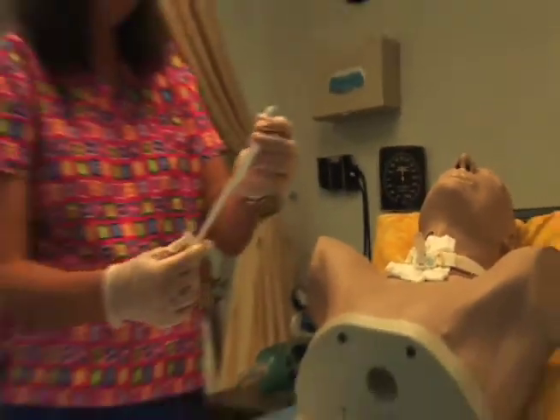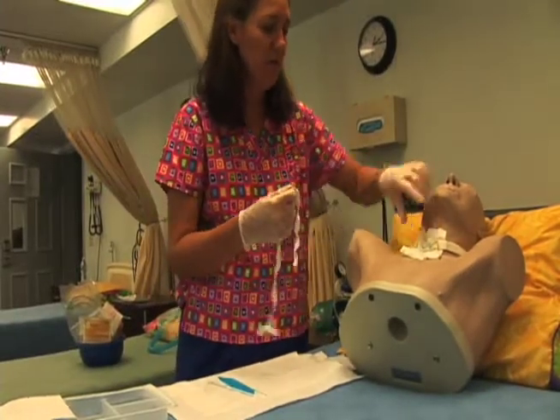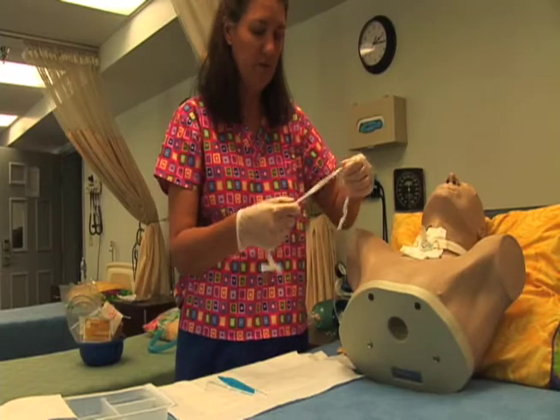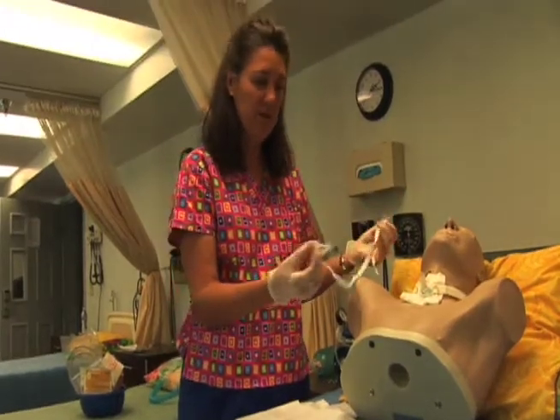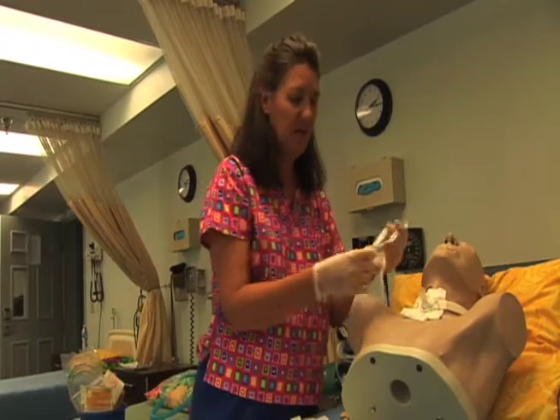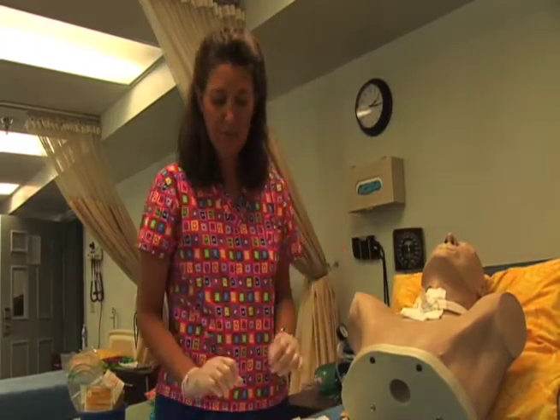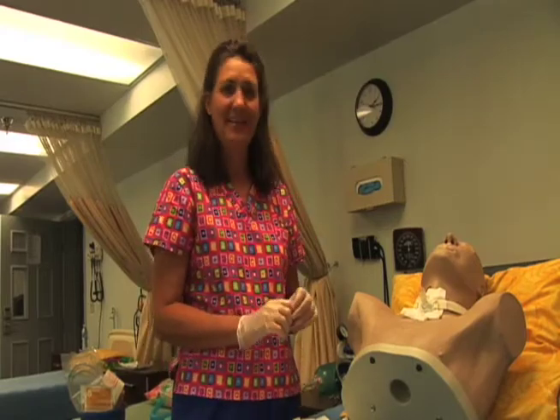And this right here is a temporary trach holder. So if this bigger one, the Velcro one, is soiled, you can put this on and you just tie it on one side, then put it around the neck and tie it on the other side. So that's what this is for. It's a temporary holder. And then you get all your trash and throw it away, and there you go.